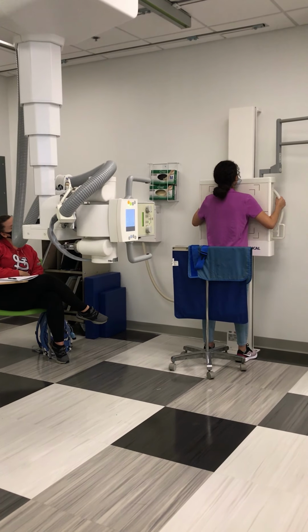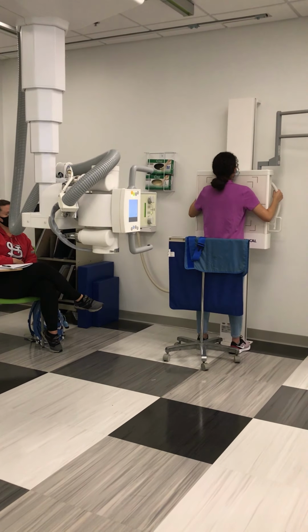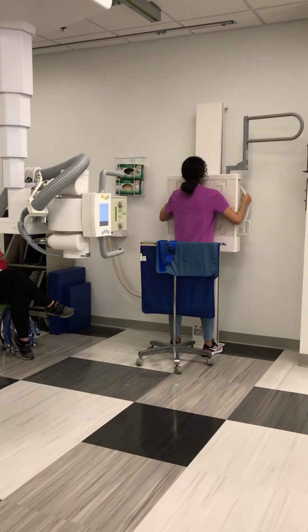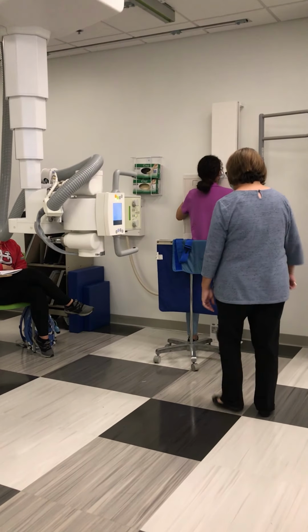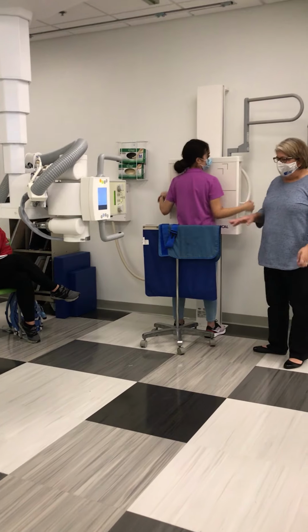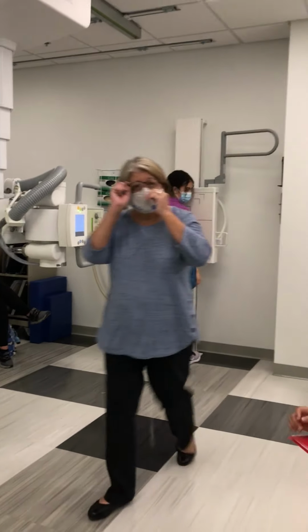So you'll come back here to this opening, and you will say, take a deep breath in, blow it all the way out, take in another deep breath, and hold it, exposure. You may breathe, and relax. So that's my PA chest. You may relax. The reason I roll the shoulders forward is because you'll see on this image the outline of the scapula.